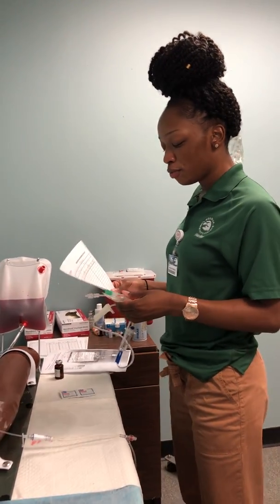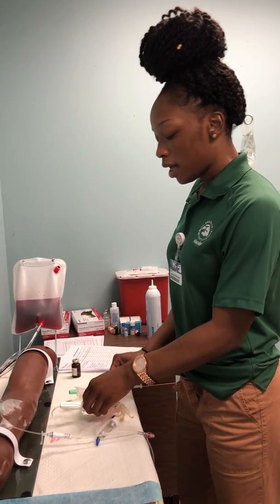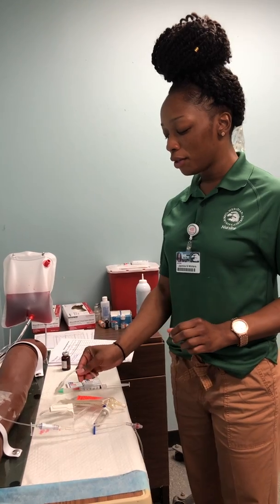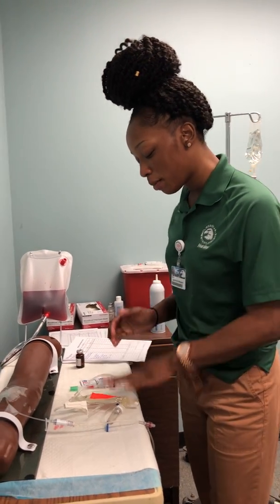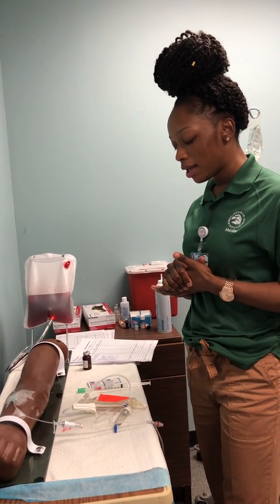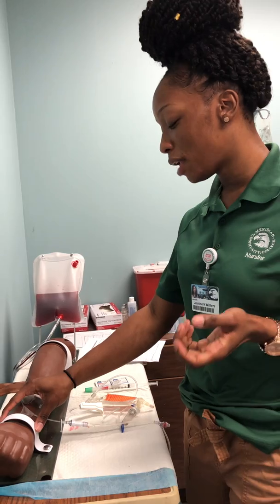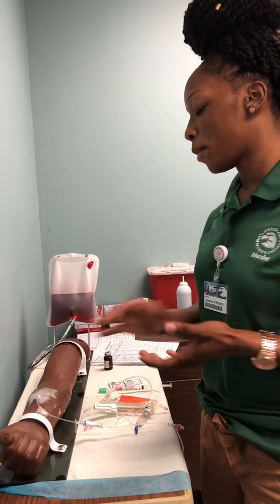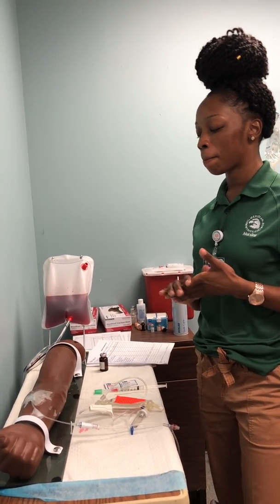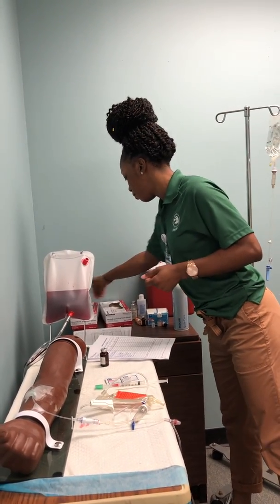When I get to the patient's room, I'll introduce myself. Knock, knock. My name is Jasmine, and I'll be your nurse today. I'm here to give you gentamicin, IV piggyback, which is an antibiotic, and IV push of Lasix. If you could tell me your name and date of birth. Okay, and do you have any allergies? Okay, and I'll wash my hands and put on my gloves.